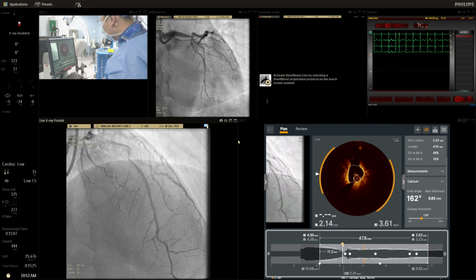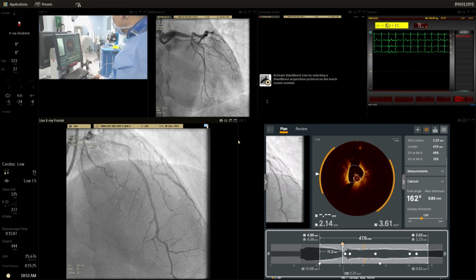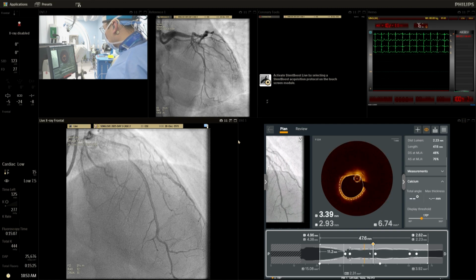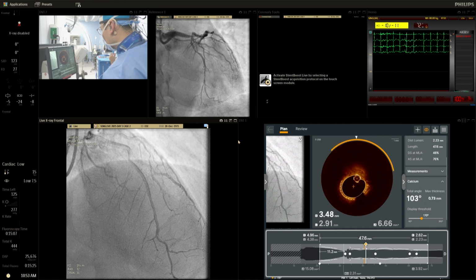That gives much more clarity to your calcification assessment. It is tough on IVUS because you see nothing behind it. It's all black and it's very, very difficult to see just white blobs and think, what does that mean? You're not quite sure what it means except 270 or above. So I think OCT is very superior in this setting when it's a distal left main bifurcation, not ostial. And you can read it very quickly.